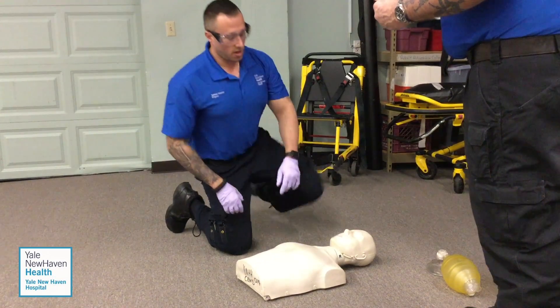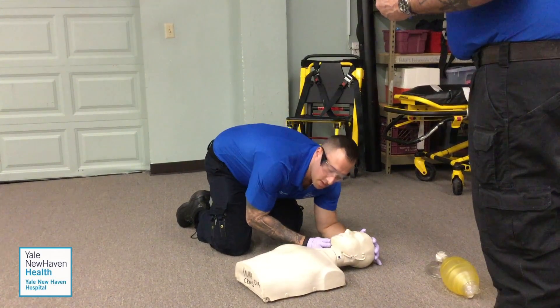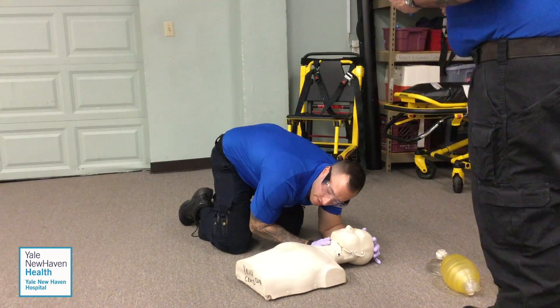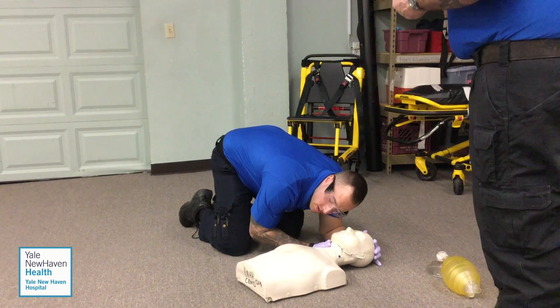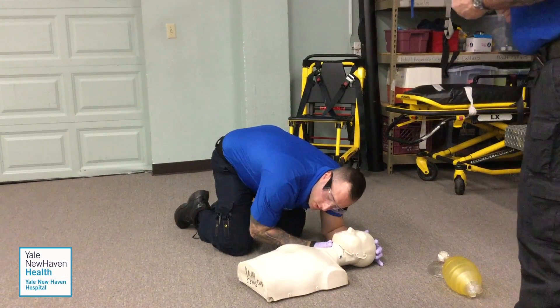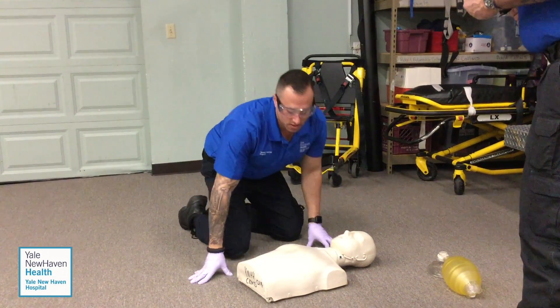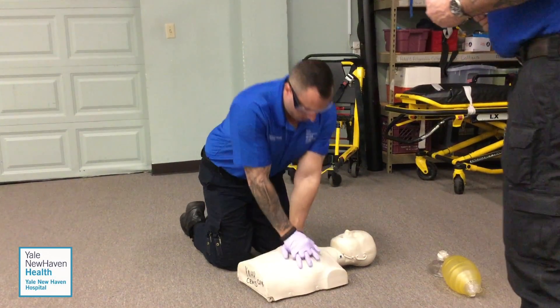I'm going to check the patient's pulse and respiratory rate simultaneously for no longer than ten seconds. If the patient is not breathing and has no pulse, I'm going to immediately start CPR — 30 compressions to 2 breaths, for five cycles.